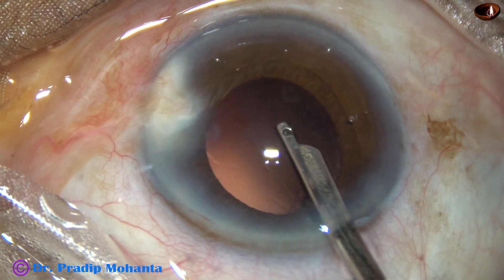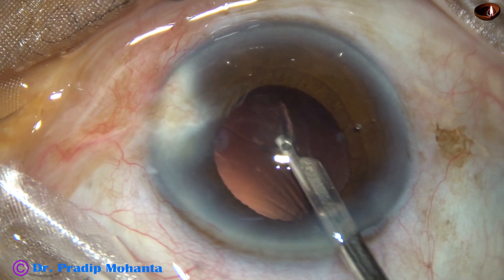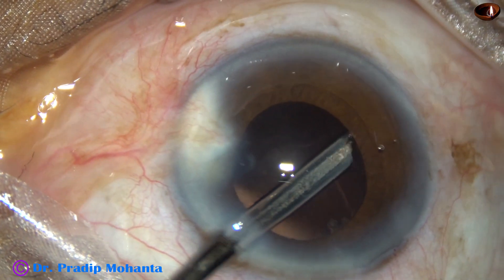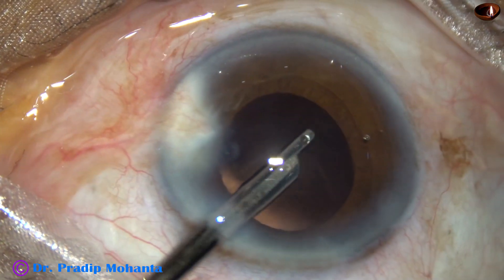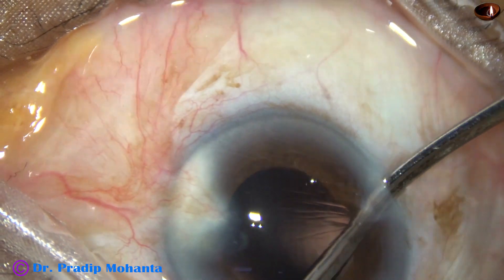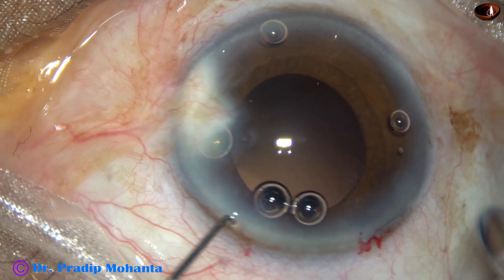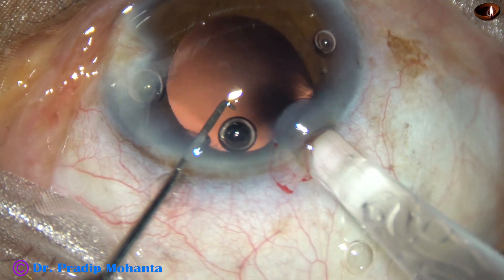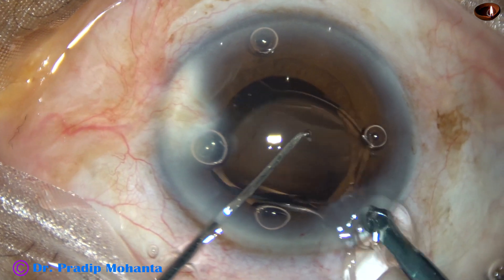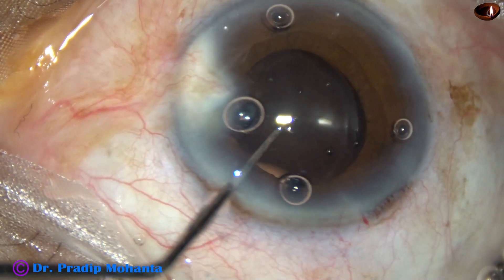After injecting some viscoelastic, the cortex is being removed with the help of a 23-gauge Simcoe cannula. In my hands, and I believe in many colleagues' hands, this instrument is safer than bimanual. Whenever you catch the posterior capsule or capsular material and pull, you have to release it — the response time with the Simcoe is faster. After injecting viscoelastic, this monofocal foldable intraocular lens is going into the capsular bag.